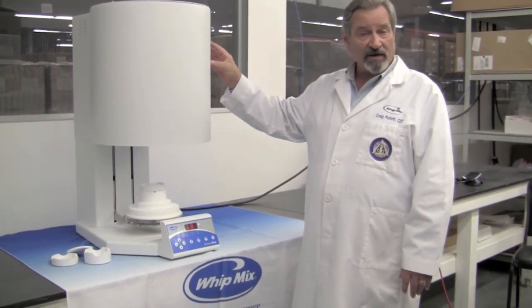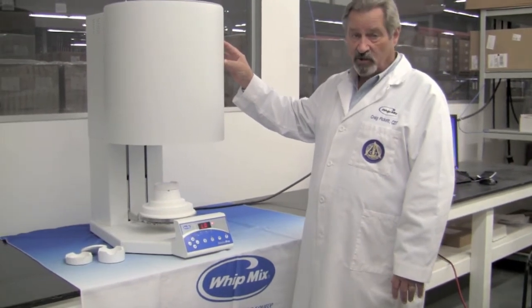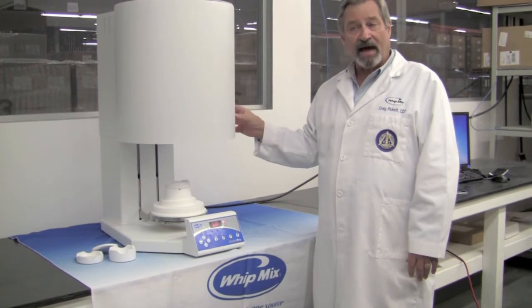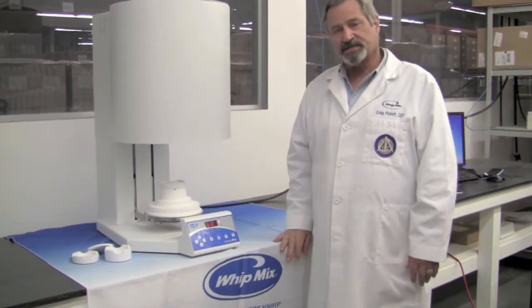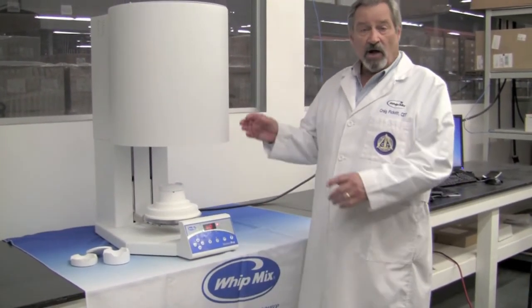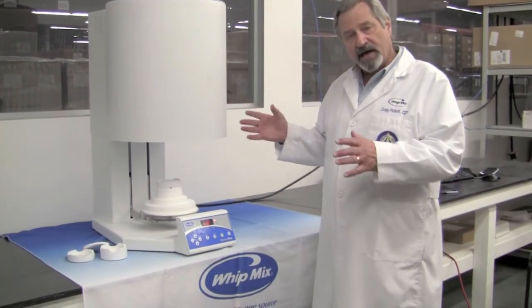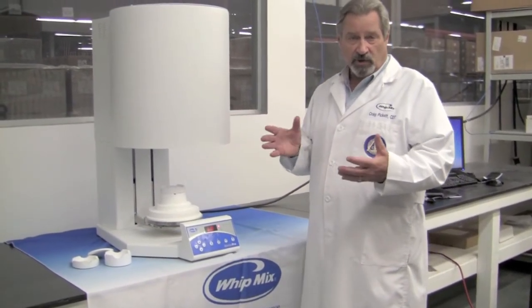It has a 1570 degrees centigrade maximum temperature and a maximum heat rise of 30 degrees centigrade per minute. It also has three adjustable cooling stages, so you are able to tailor your sintering program to your desires.